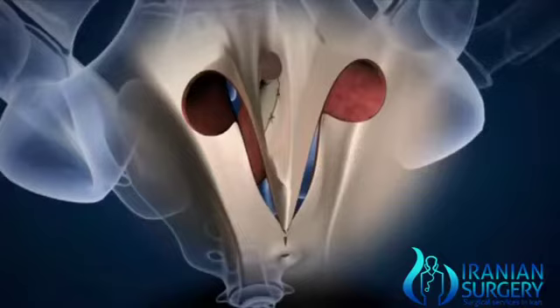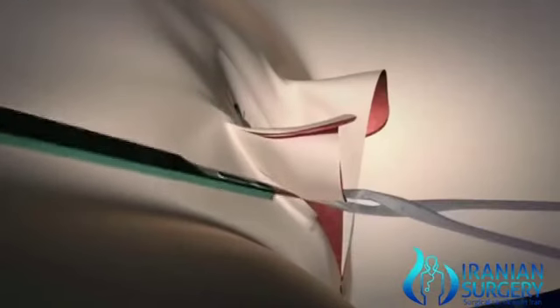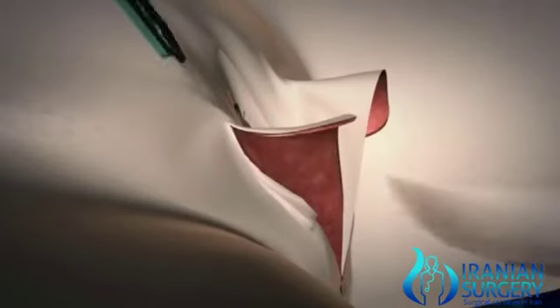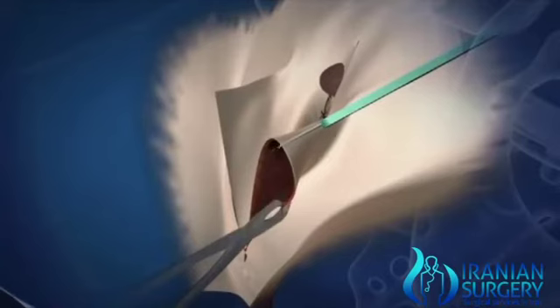Finally, excess skin is removed to achieve the normal shape of a vagina. This is followed by skin repair, and this is where the gender reassignment surgery ends.